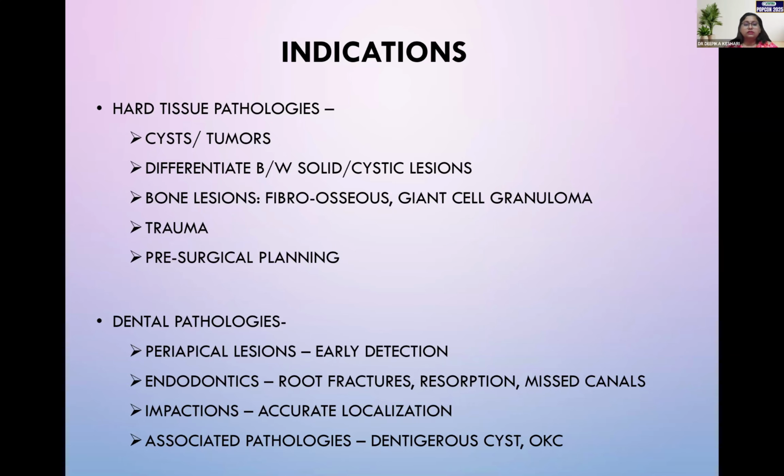Then for dental pathologies, we can assess different periapical lesions, which we'll see later in the session. Then also for endodontics, like root fractures, resorption, and missed canals. Then for accurate localization of impacted teeth and associated pathologies with impactions, like dentigerous cyst and KCOT.